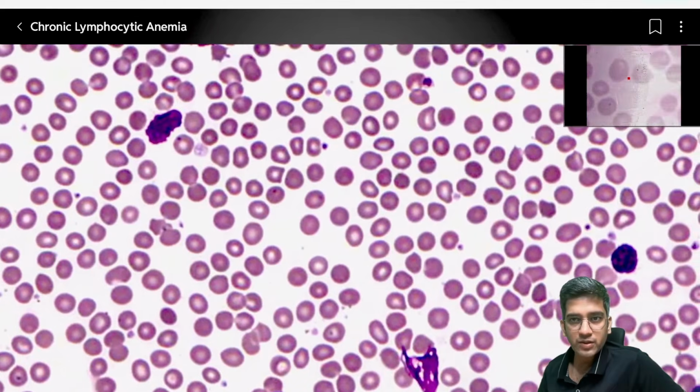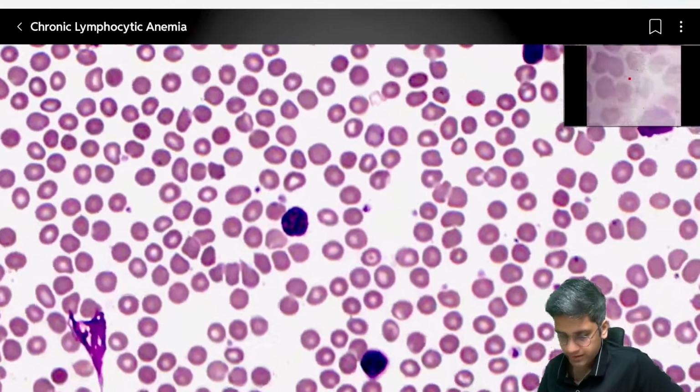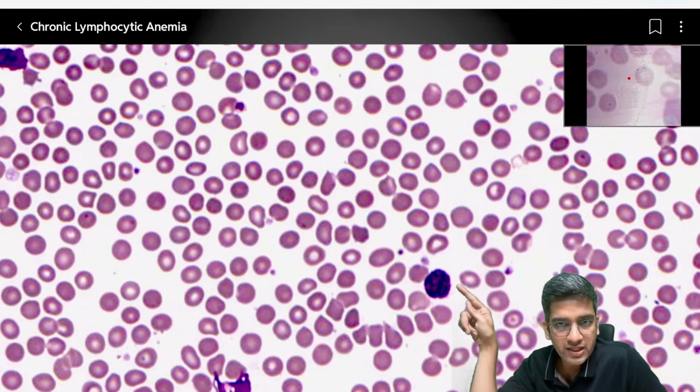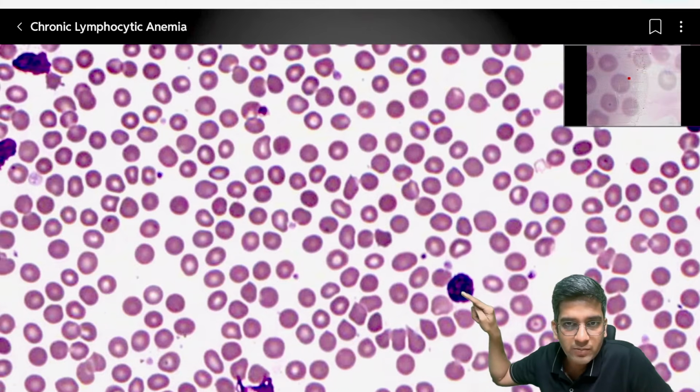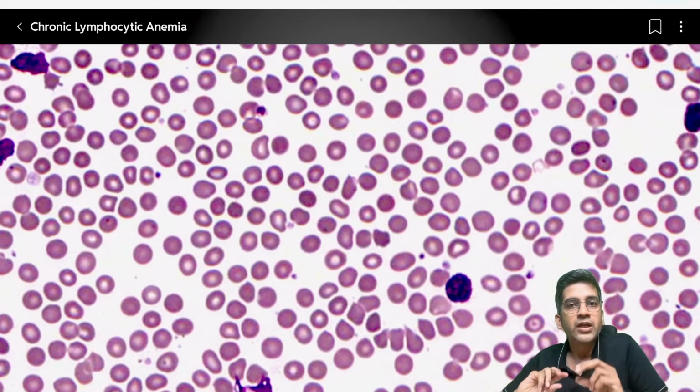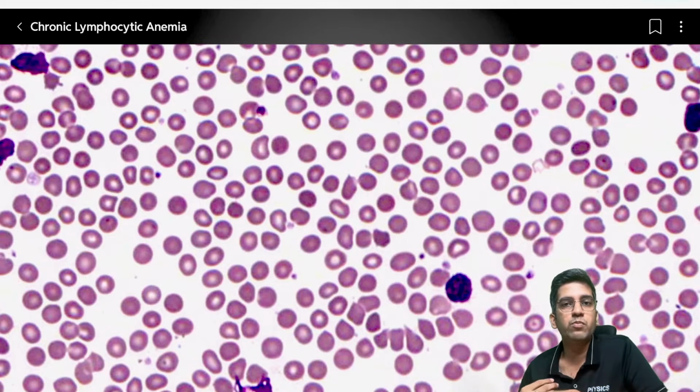This is very dark, look at this. This might help me to explain that. I'm not sure if you'll be able to appreciate it. But this nucleus, if you look at this nucleus, I do have dark areas as well as a little bit of light areas, right? Light area, light area, light area, dark area. This alternating light area and dark area gives the appearance of a football. So they call it a football chromatin. The chromatin looks like a football.